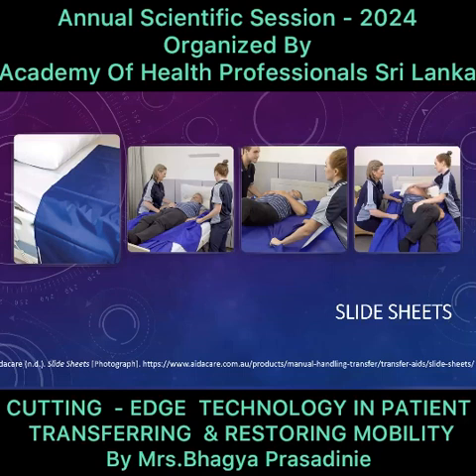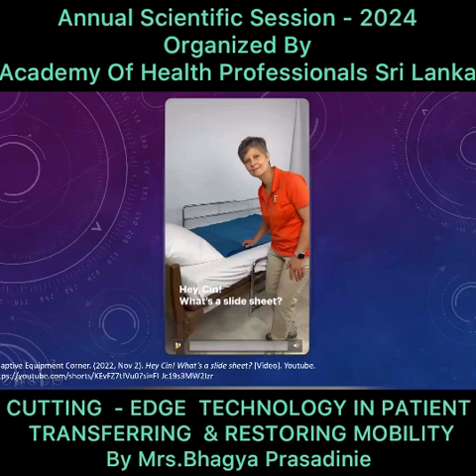So what we do is we just place 2 sheets under the patient, and we move the first sheet, the top sheet. And when we move the top sheet, we cannot feel the weight of the patient because the 2 sheets are sliding on each other. That is why we call them slide sheets. So we'll see a video on that.